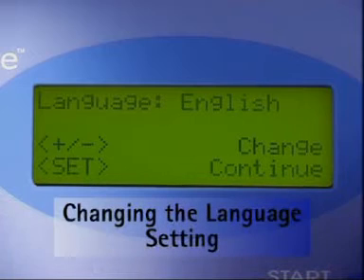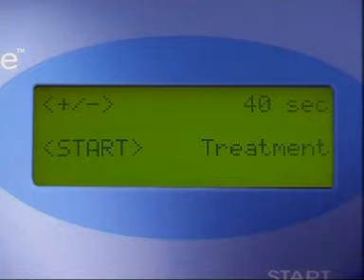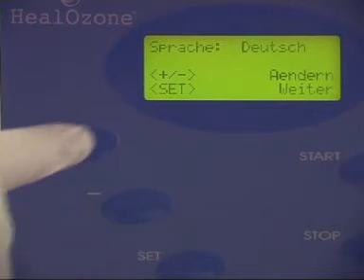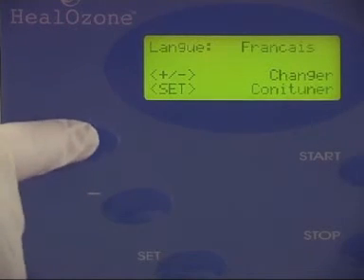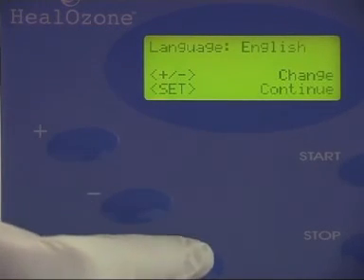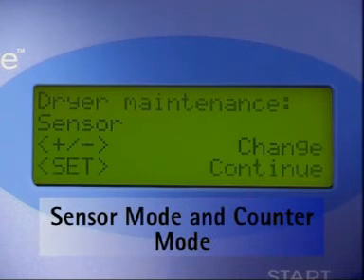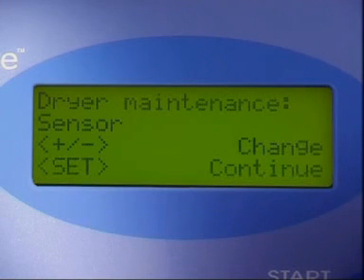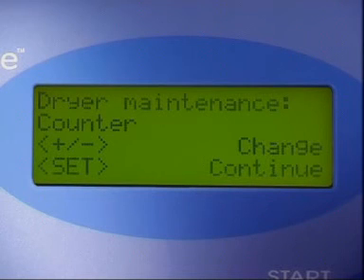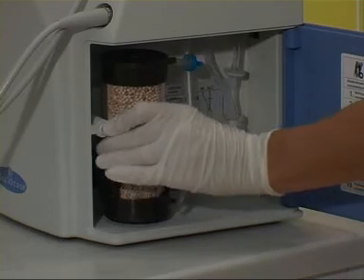What if you want to change the language setting of the display? Go to the main menu and hold down the set button for approximately 2 or 3 seconds. Using the plus or minus button, choose the language you require and press the set button to confirm. Pressing the set button again will take you to default sensor mode. By choosing the minus button, you can switch to counter mode, which means that you will be prompted to replace the air dryer after a set number of treatments.